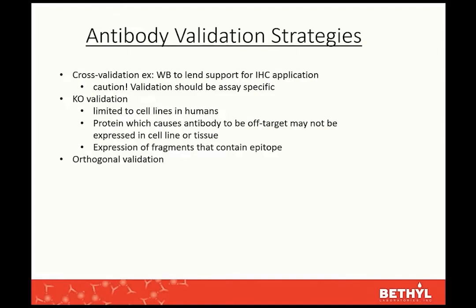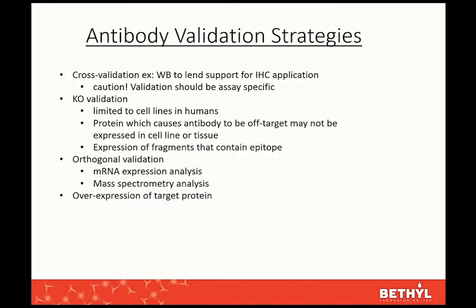So also there is confirming that there is actual messenger RNA expression in the tissue, or you can do mass spec analysis. The only problem with this method is that we all know there's a long history in the publication record where messenger RNA doesn't match up with protein expression all the time in every instance.